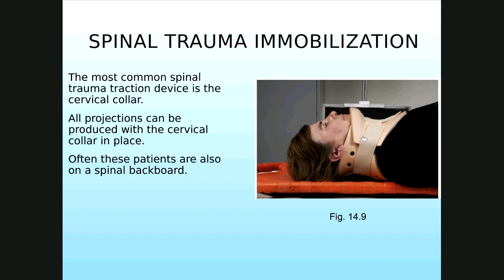And the cervical collar is typically on a patient when they suspect cervical injury. Most motor vehicle accidents, you will find patients come in with these on through the ambulance. But what it's doing is to immobilize the cervical spine to prevent motion so that you reduce the potential of a traumatic injury to the spine and risk paralysis. So a lot of times they're placed in these cervical collars.